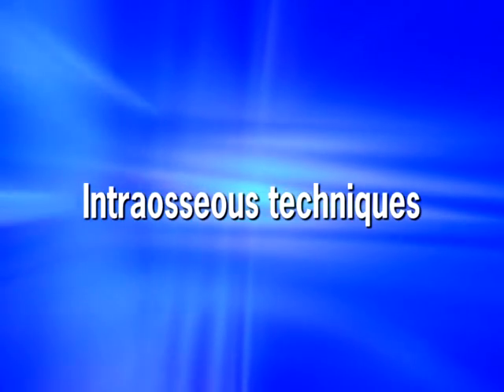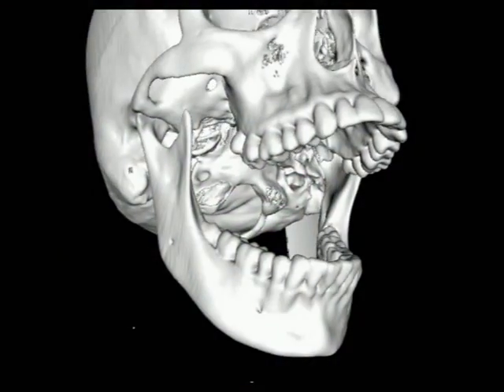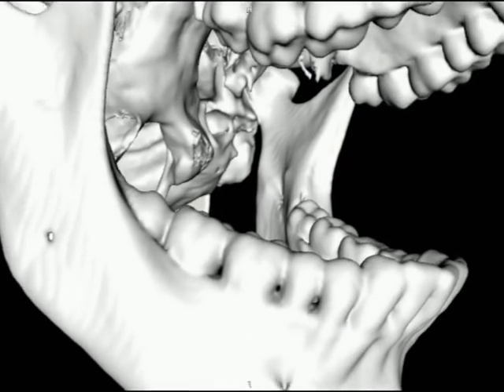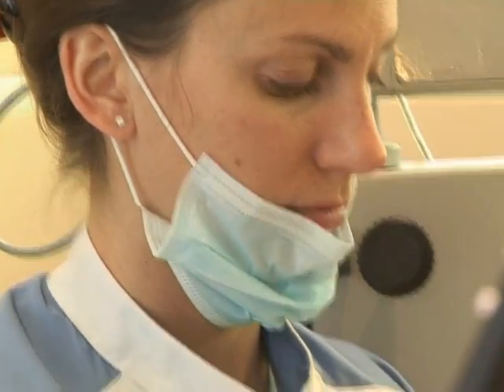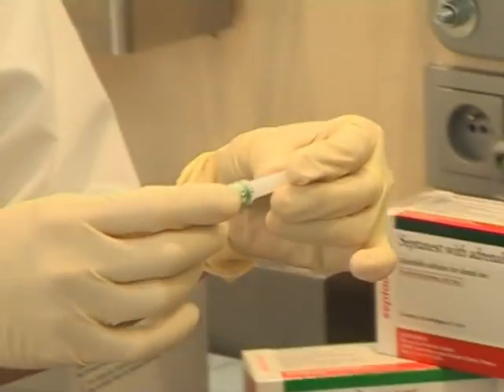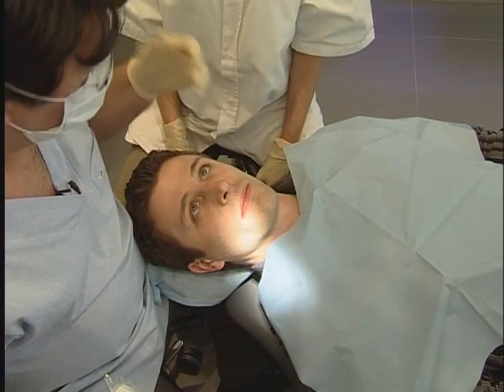The intraosseous techniques are very popular at present, as they are limited to a small area. Used as first-line measures for short-duration procedures, they do not produce the unpleasant effects that occur with mandibular blocks, for example, labiomental and lingual anesthesia. They are also a very effective weapon in our armory of supplementary anesthesia techniques, particularly when tissue inflammation alters the response threshold of the nociceptive fibers, thus requiring us to combine several techniques to overcome this failure.